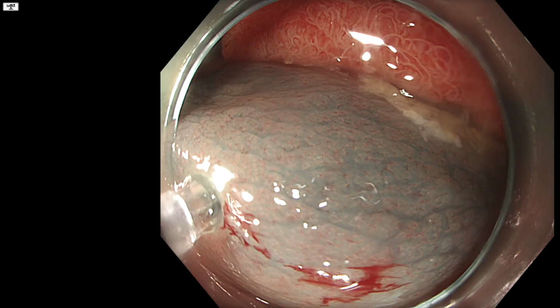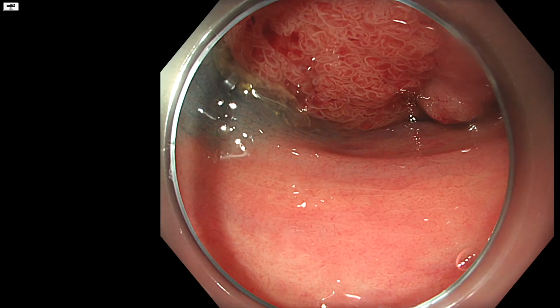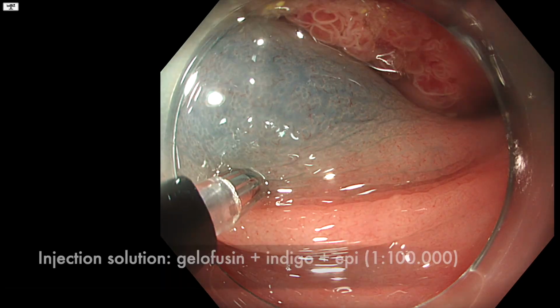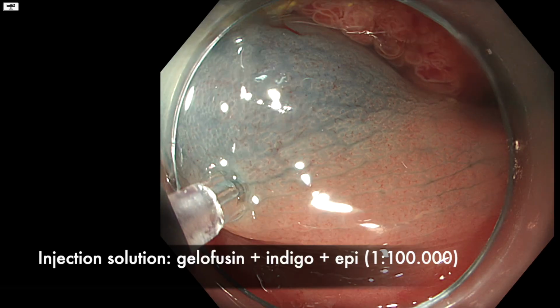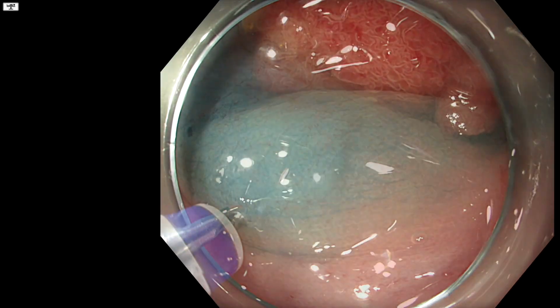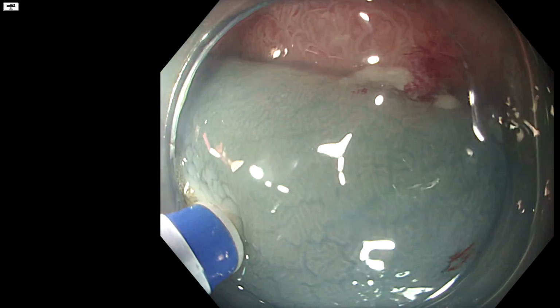So we're starting in the retroflected position with some injection. The fluid I usually use contains gelafusin with a small amount of indigo carmine and a low concentration of epinephrine, which is usually 1 to 100,000 to 1 to 200,000.